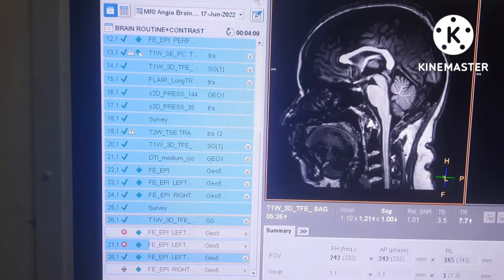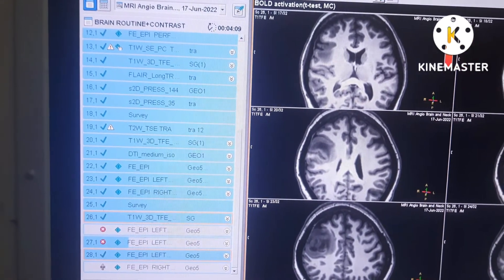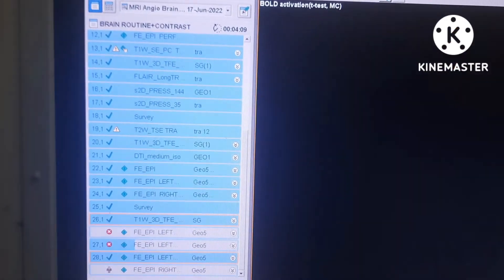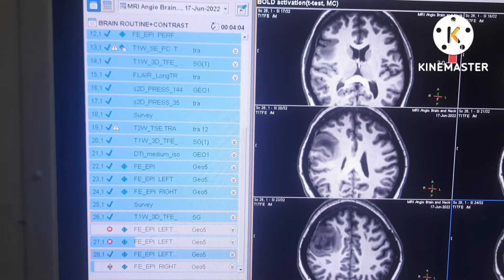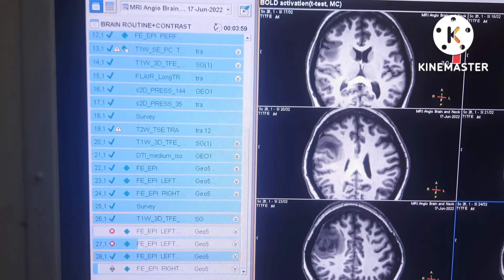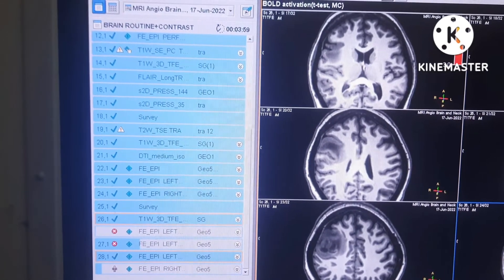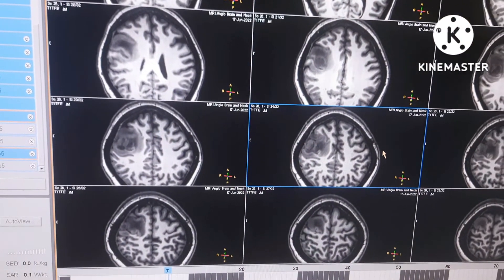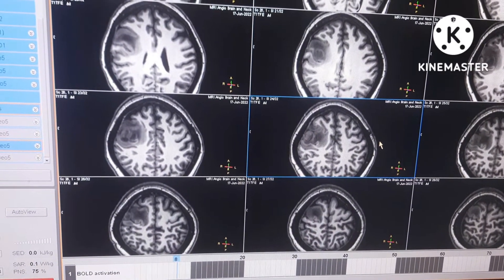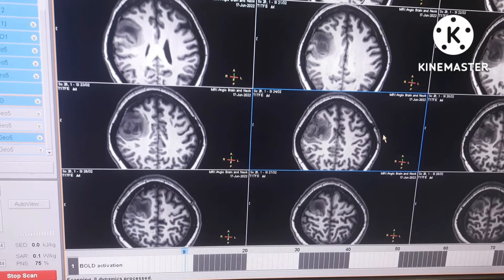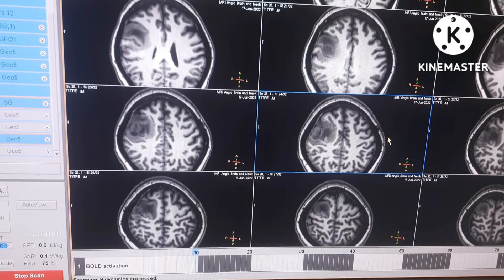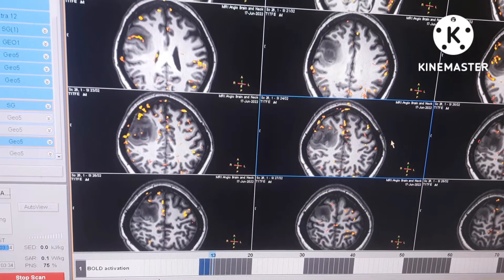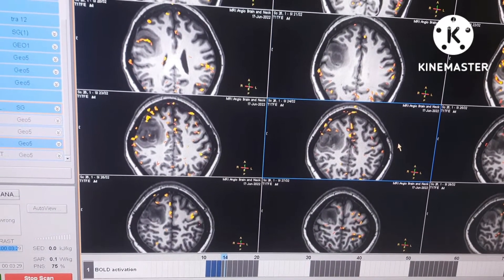We will start the color map also. In many patients we will perform scanning for both wrist movement and elbow movements. Now the patient is in rest condition. After dynamic 10, the patient will move the right elbow. Make sure the patient is moving by themselves.